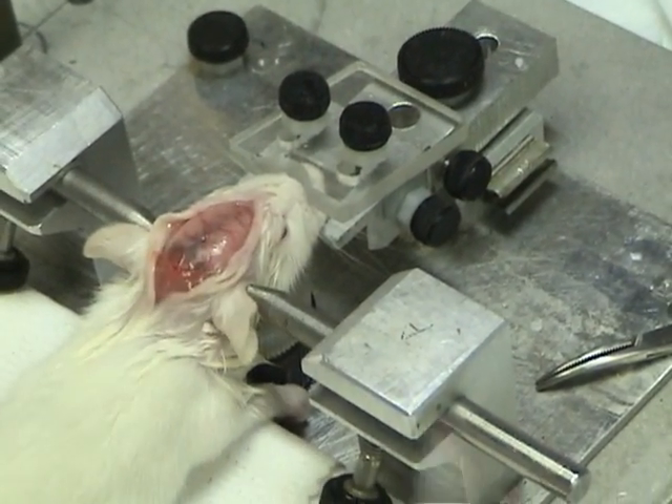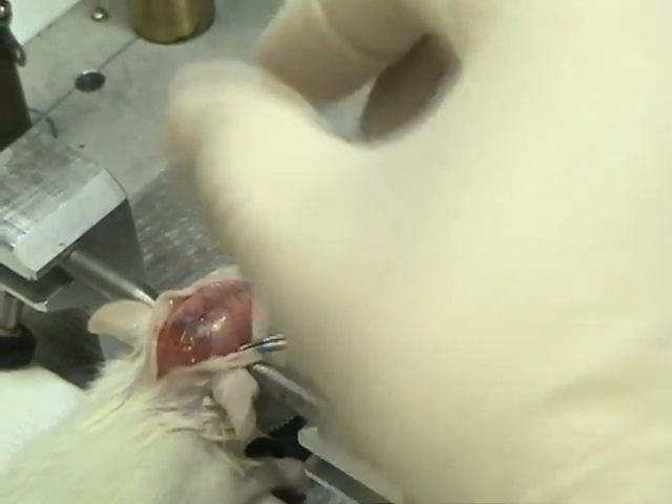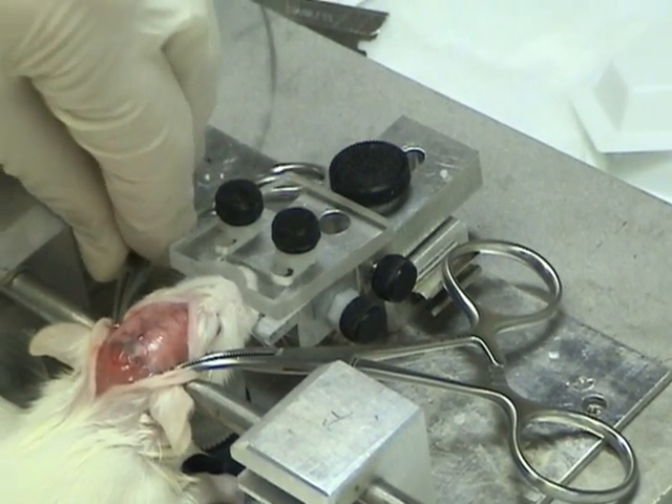You have to wait 5 minutes to dry up the scalp. Make a big space — enough space to do something on the scalp, like this.